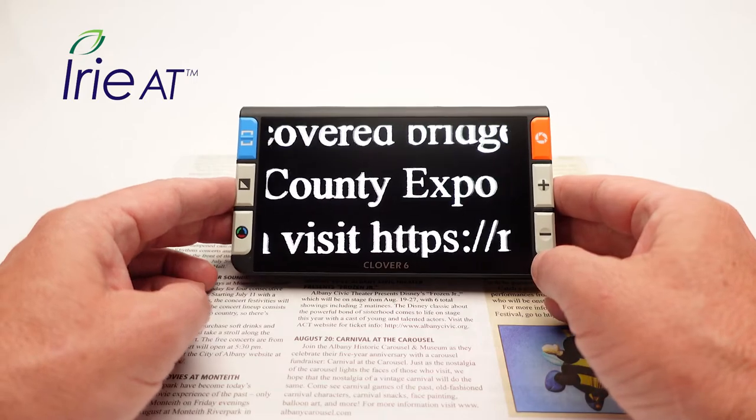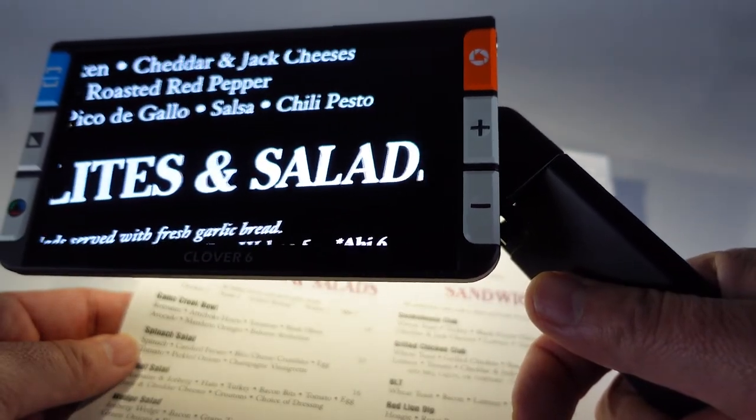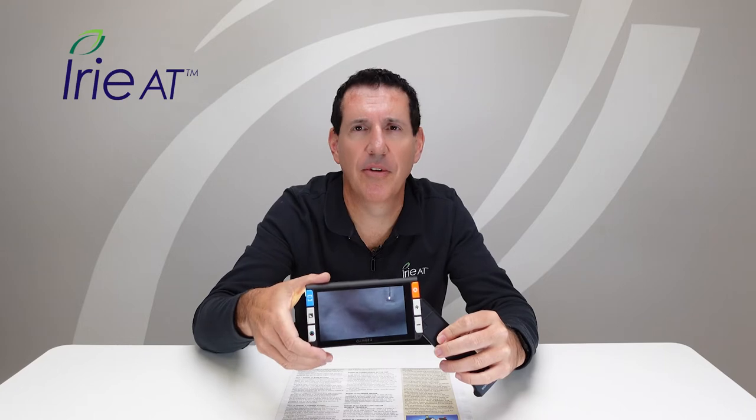To read, all you have to do is place the Clover 6 on top of the reading material and move it around to read at your pleasure. You can also extend the handle and use it like a magnifying glass — especially useful if you're out and about, maybe checking prices at a supermarket or reading a menu in a dark restaurant. If you want to read at a distance, pivot the handle in and it'll show a picture of a mountain on screen for far view, or flowers for close view. Then you can hold it up and look at signs or menus across the counter at Starbucks or wherever you are.